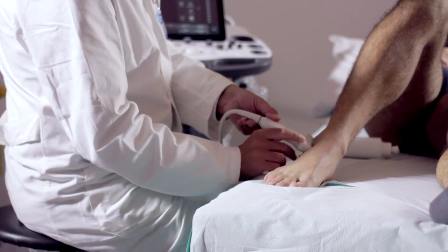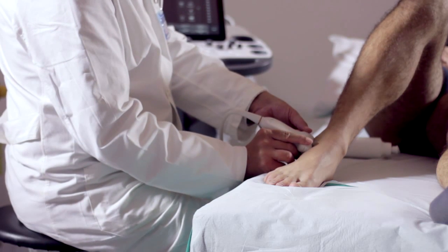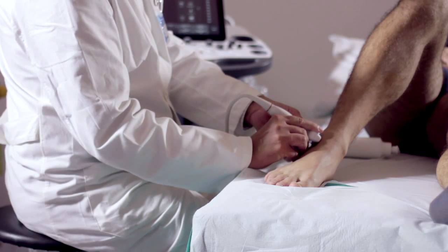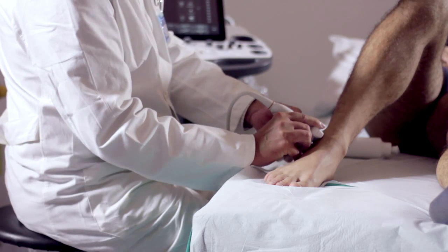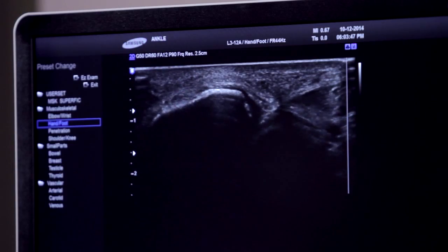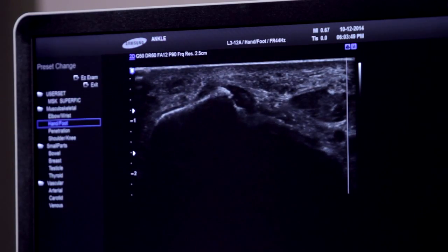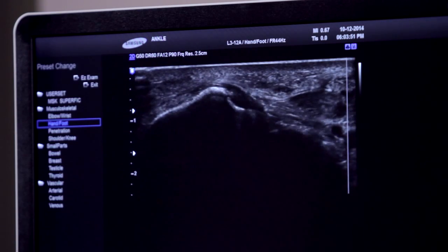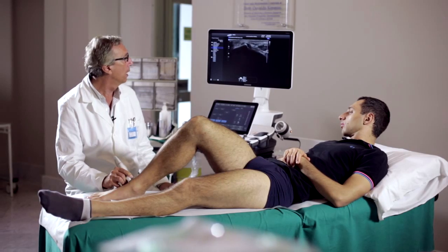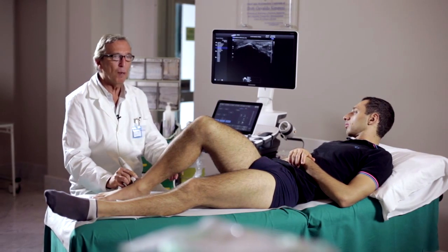If we do the scan sliding upwards, we find another very important structure proximal to this ligament, that is the anterior tibiofibular ligament. This ligament naturally extends between the front side surface of the tibia and the fibula. We now study a third ligament, really well shown thanks to the ultrasound, called the calcaneofibular ligament.